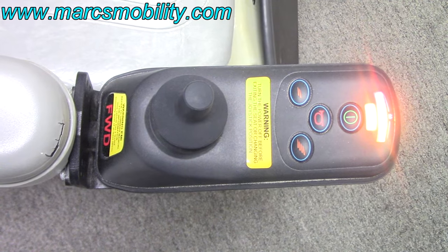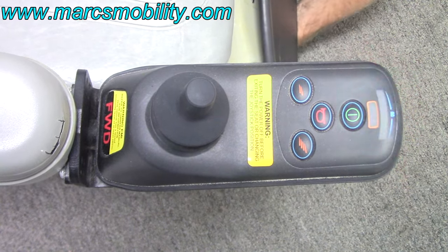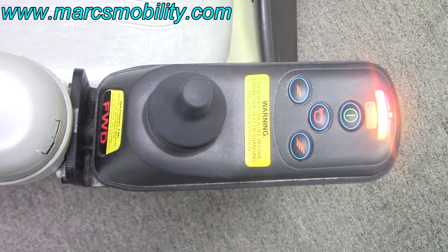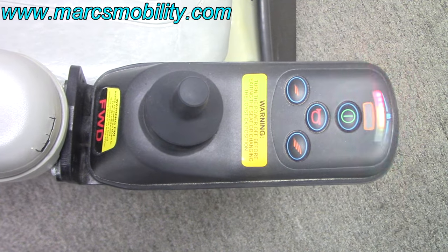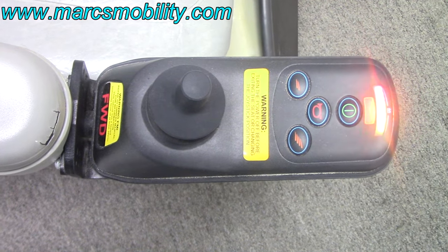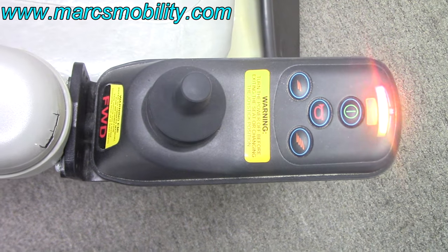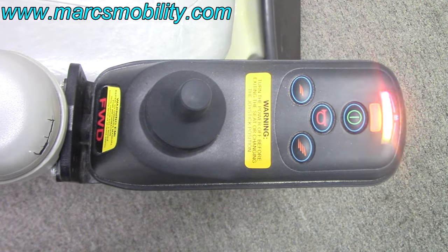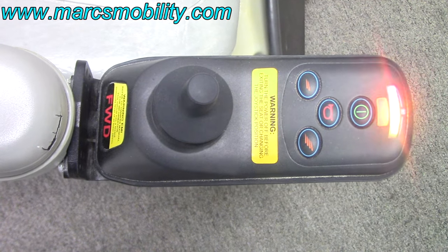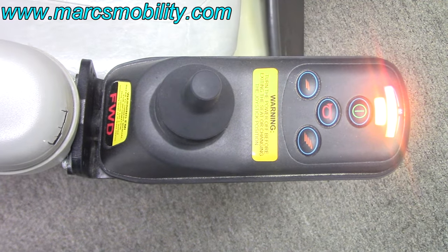For example, if I put this chair in neutral, you will see the lights start to flash — and now you have nine flashing lights. Nine flashing lights means your park brakes have a bad connection, but most typically when you see nine flashing lights, the chair is in neutral. To fix this, put the chair back into gear and turn the power off and back on to reset it.